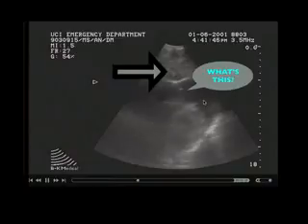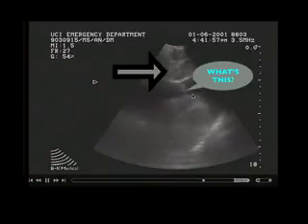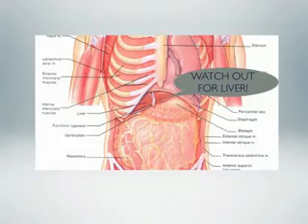Tamponade is readily visible, and we'll explain shortly why there's the catheter, by the way. We'll explain now why it is not typically too crucial that the liver has a needle going through it. Just looking at the anatomy here, you can see that if you go subxiphoid at a 45-degree angle, aiming towards the shoulder, one just about has to go through the liver.